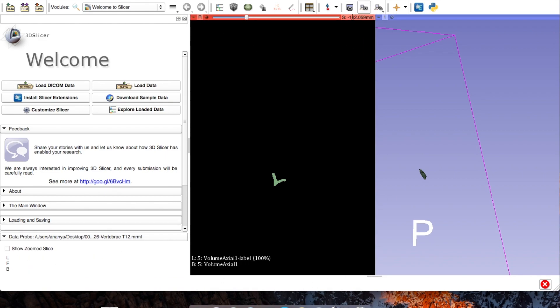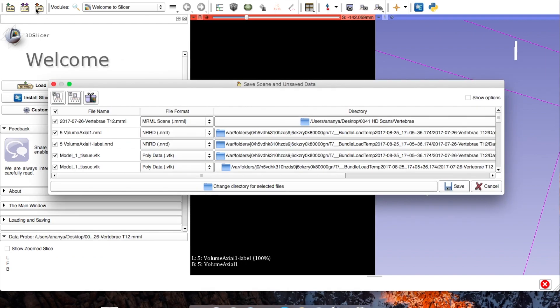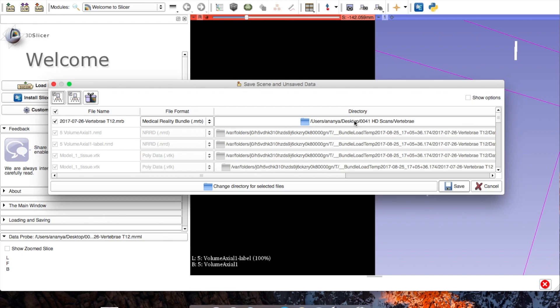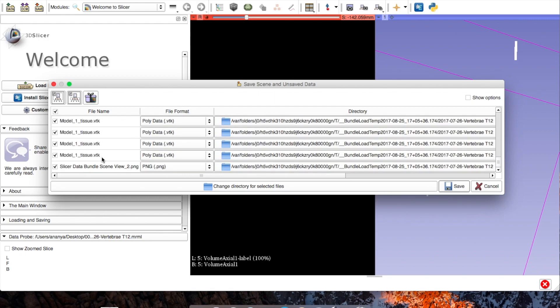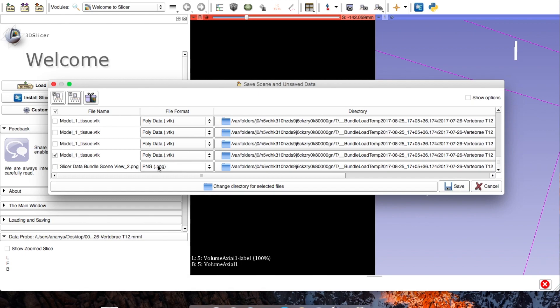Now we've done 12 vertebrae, 24 ribs, and isolated the sternum. Let's talk about saving. Go to the top-left save icon, click it, and the first time uncheck the gift box so nothing's selected, then choose your file directory. You'll also want an STL file — click the box, scroll to the very bottom, select the second from bottom option so that's the only one selected, go to the drop-down menu, select STL, change your directory if you want, and save. That was a brief but thorough introduction to 3D Slicer — good luck, and if you have any questions feel free to email me.